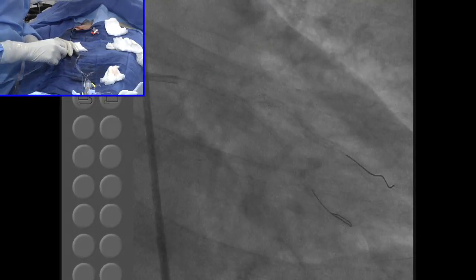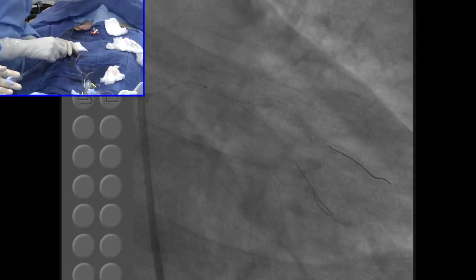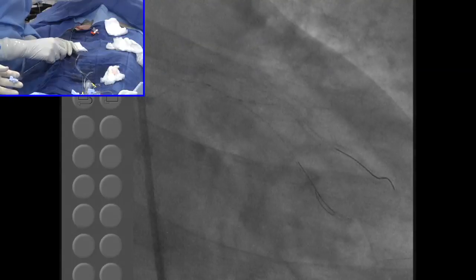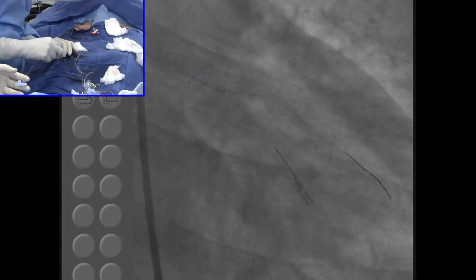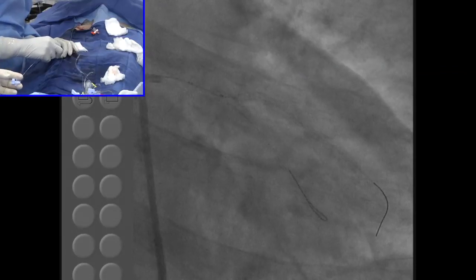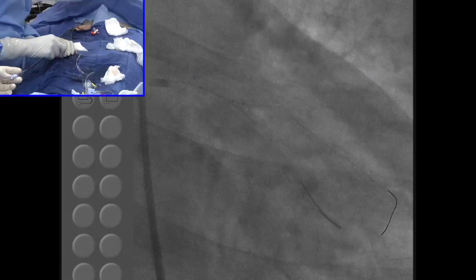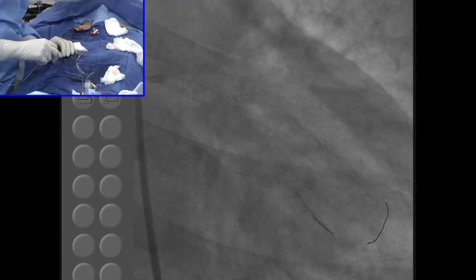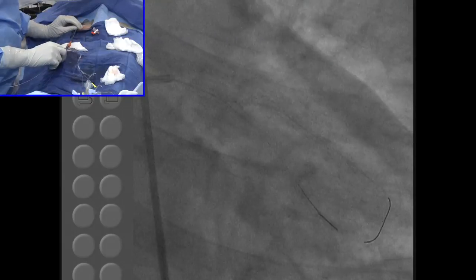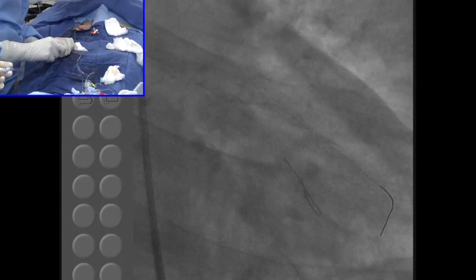Because many times, believe me, I have been to live workshops, and they all try to go through it. They try high pressure, a previously inflated balloon never goes. Never goes. So even this compliant balloon is having a tough time. Now then you go with the 1.5 by 12 first. Or maybe again, one thing you can do, you recross. You have that 2.0? We had the 2.0 by 12, but we had used it. Still go. That's fine.